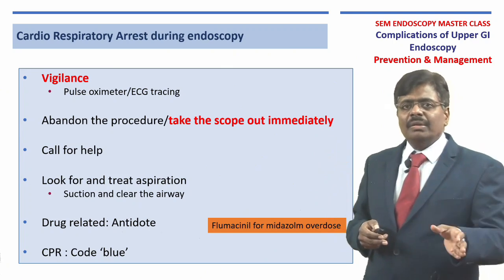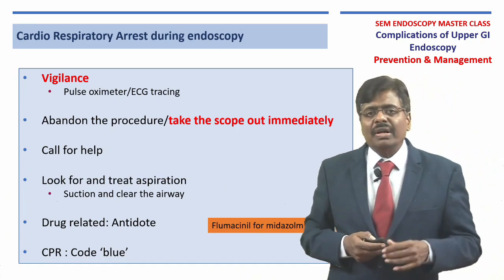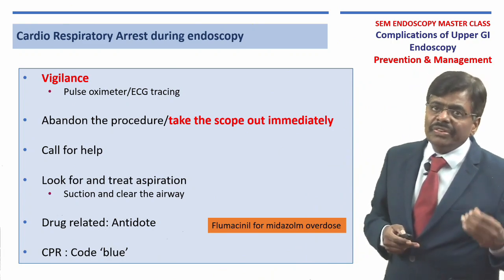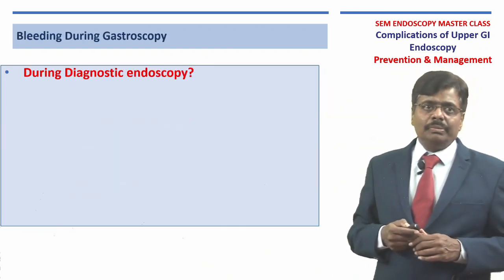If the patient goes into something like a respiratory arrest or a cardiac standstill, immediately take the scope out and put the patient supine, get an ambu bag and do CPR and ask for help. Code blue has to be initiated. And if you think it is due to a drug like midazolam, then you may have to consider flumazenil, which is an antidote for midazolam.